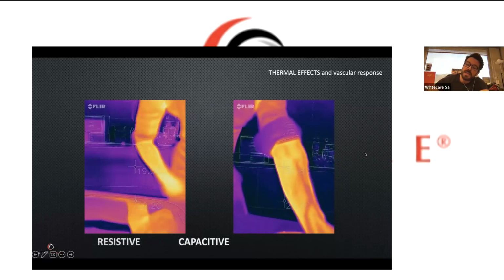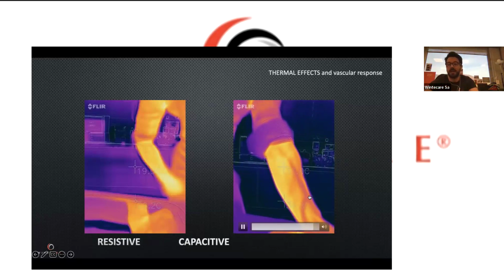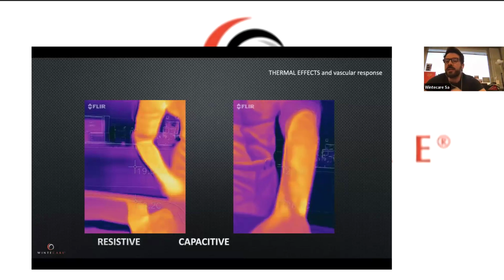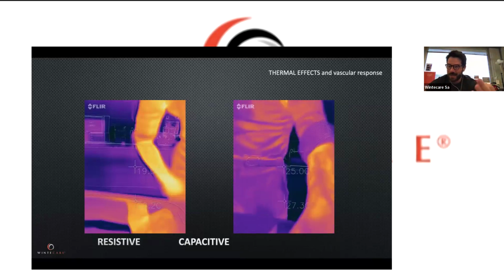See the vascular response, how prominent it is, okay? Something deep, something macroscopic. It is not just microcirculation, it's actually blood perfusion.